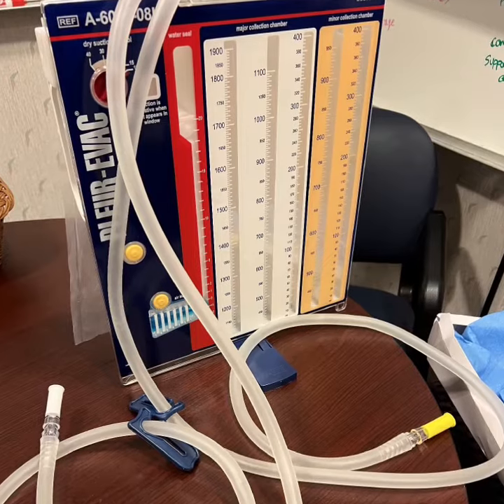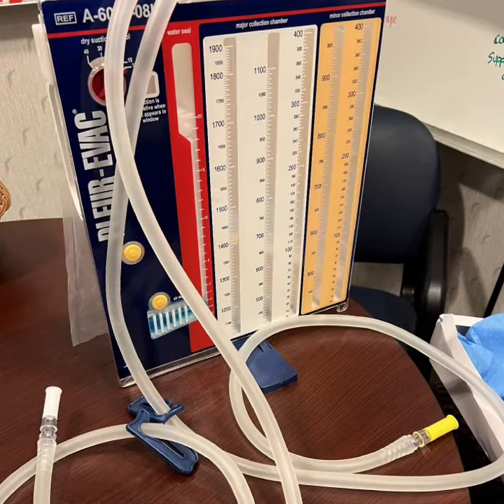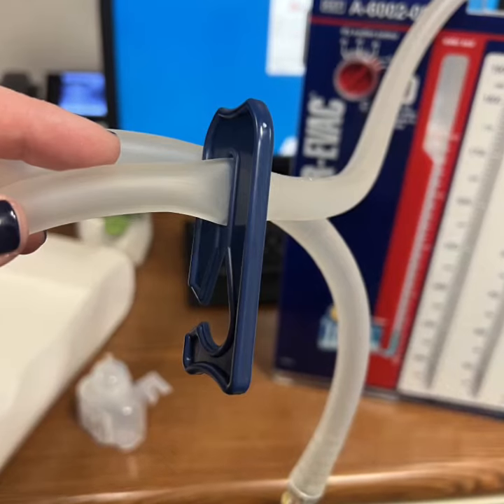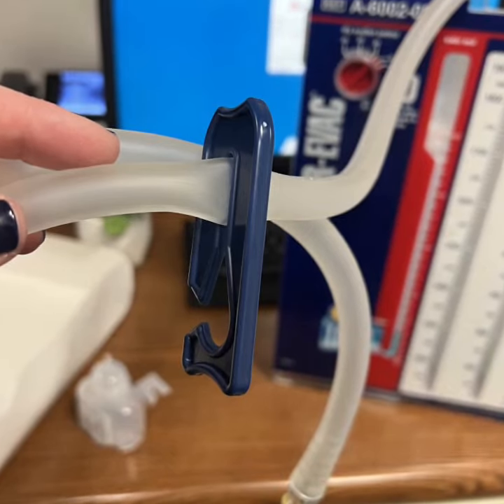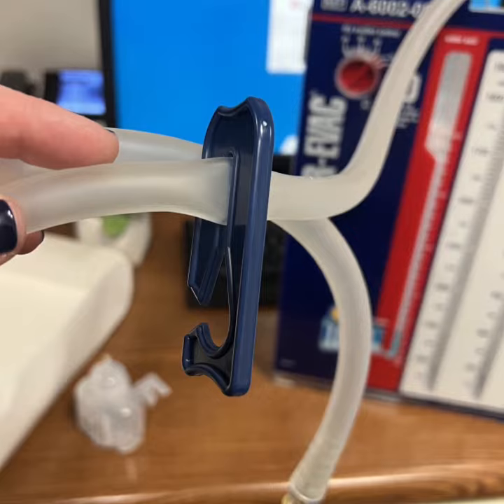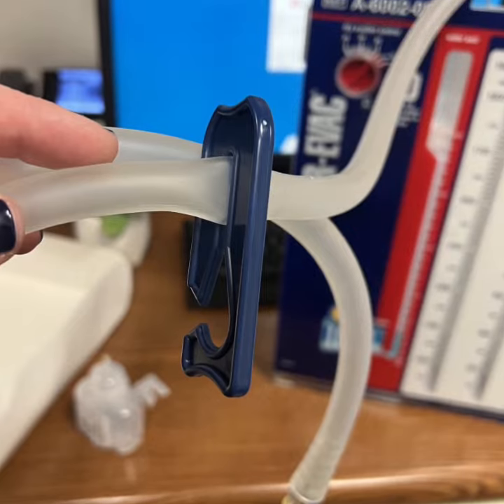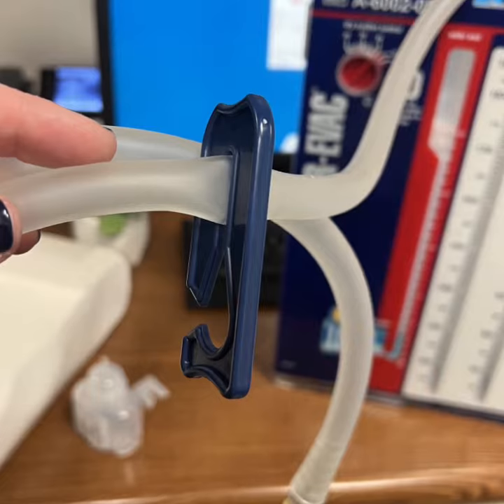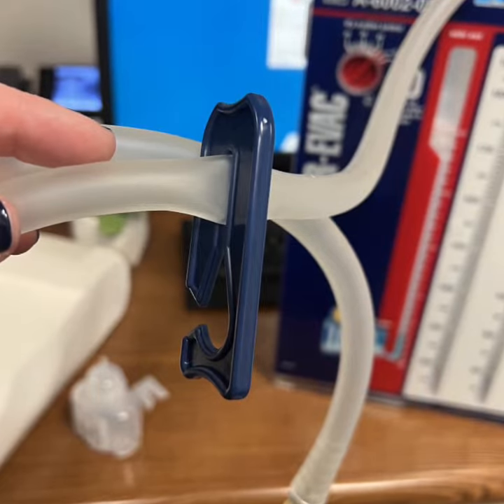This Plurivac container can be used to hook up two separate chest tubes. If you are using it for only one chest tube, completely clamp the unused tubing so the system remains closed and sterile and so that there is no bubbling in the water from the unused tubing.